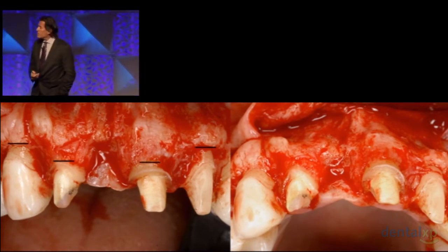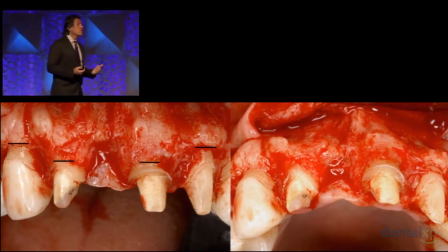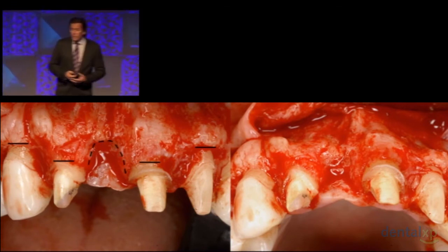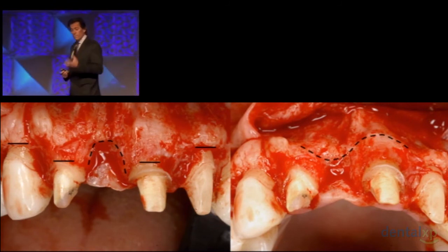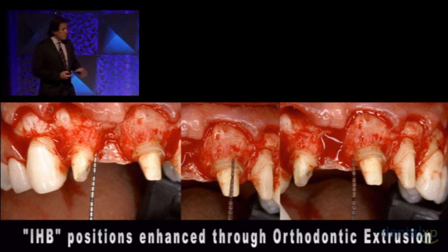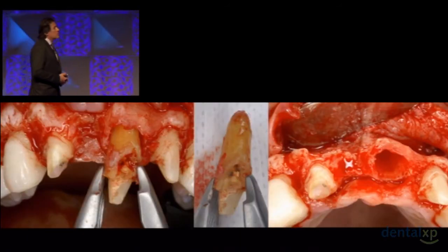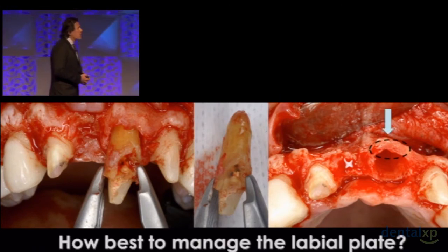The lateral and the central, actually the bone has come down the same amount as the soft tissue. And more importantly, if we take a look at the defect around the central, we certainly have to deal with that defect buccolingually, but more importantly, if I probe interproximally, the interproximal height of bone, the bone is present on those teeth. We've enhanced that particular area. So now I can extract the tooth with the resorptive defect, and I can deal with a buccolingual defect on the right central and an extraction site defect on the left central.